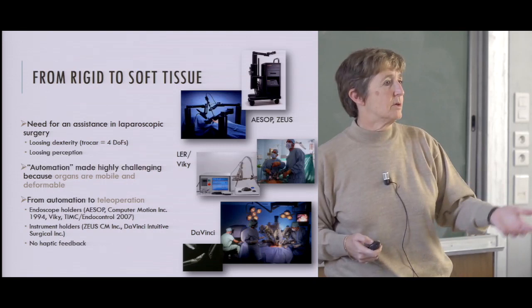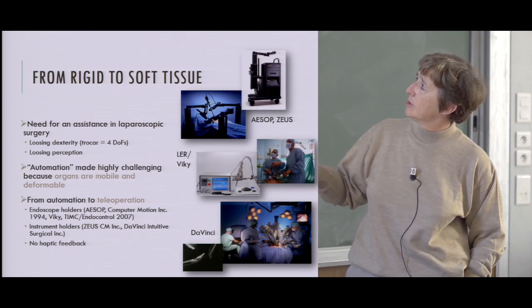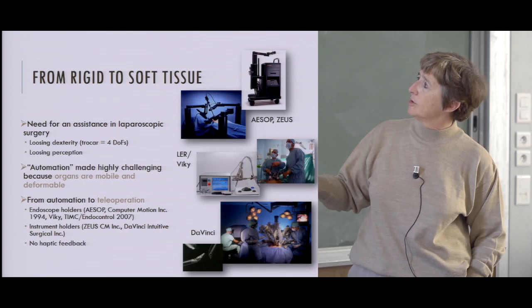Okay, and after people, okay, you have light version of that. We developed that in Grenoble, which is a lighter version of this system, also controlled by voice. And those are more recent systems which not only carry cameras, but also instrument. It's the Da Vinci system.